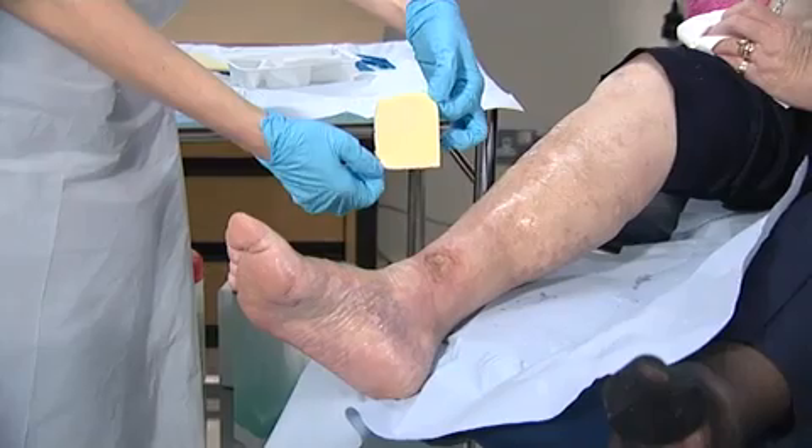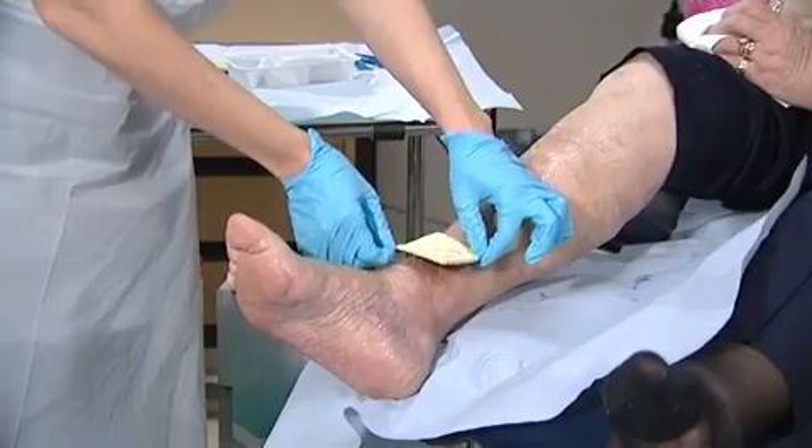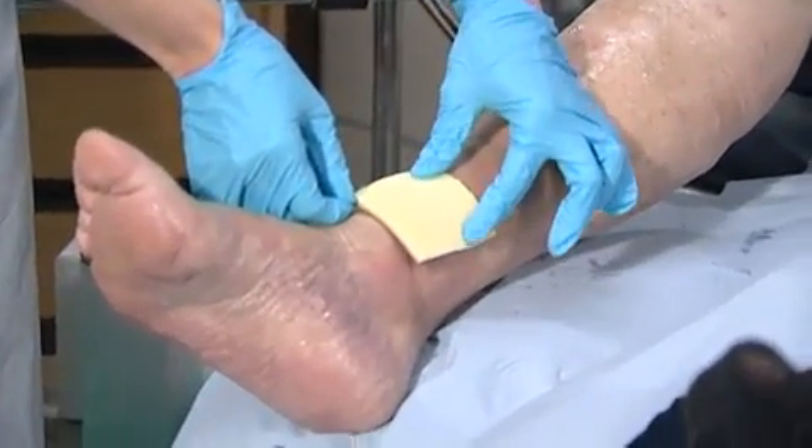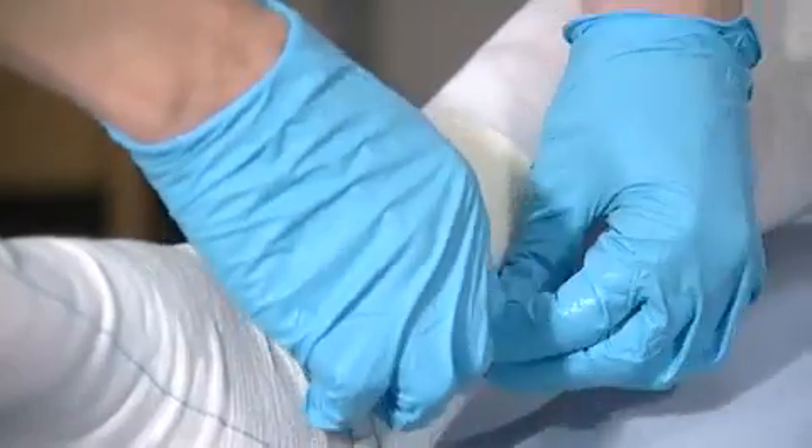Apply the dark grey side of the dressing to the wound. Unlike other silver dressings, it's not necessary to wet the dressing at this stage. Secure the dressing using a secondary dressing or retention bandage to keep it in place.